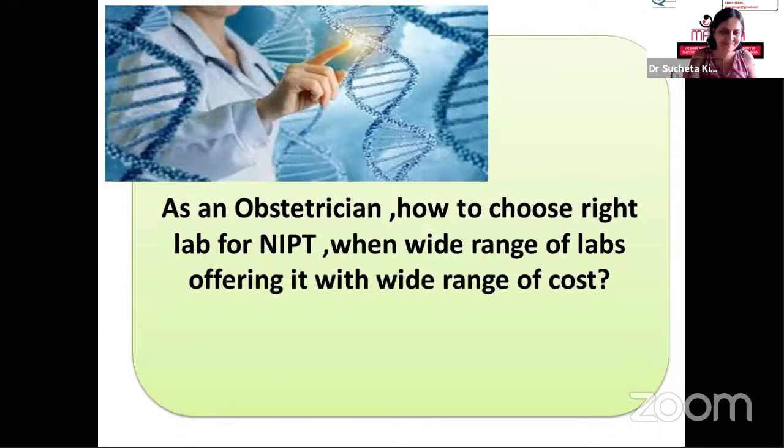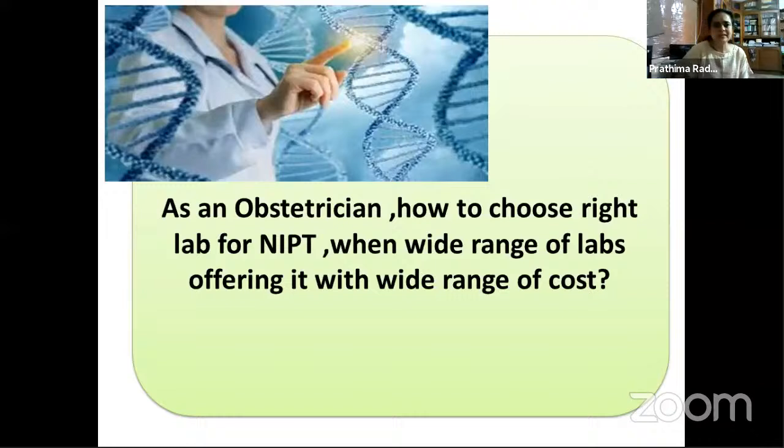No, see, I think first of all, we must understand that when you're commenting on the images and the laboratories, it's not against any person. In fact, I don't even know who's done the scan or which laboratory. When they email the images, most of the time they're just images. And the moment you see the image, you know whether you should rely on it or not.